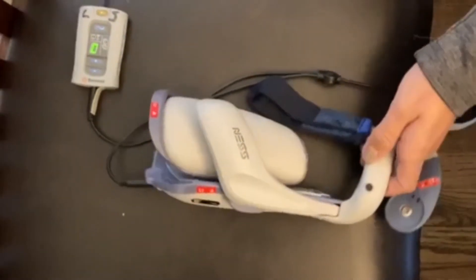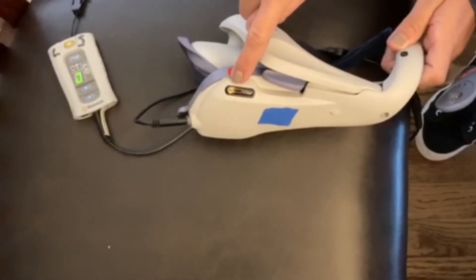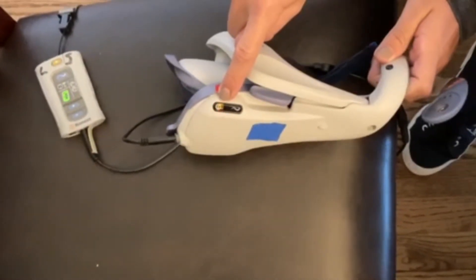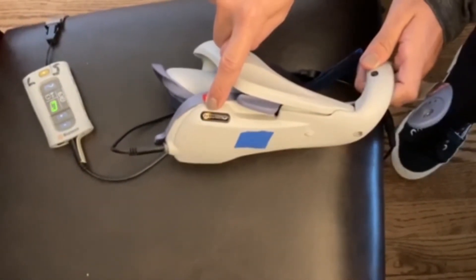Your first step is to make sure that everything is charging. The orthosis light indicator is right here. When it's flashing green and yellow, it's letting you know that it's being charged. When there's a solid green, you'll know that the orthosis is fully charged.